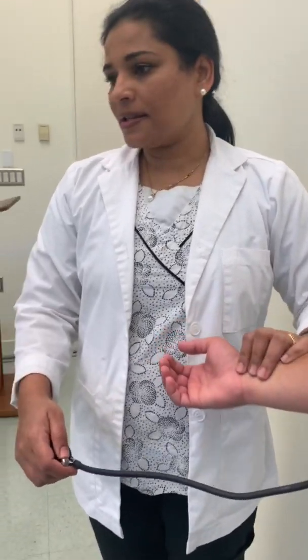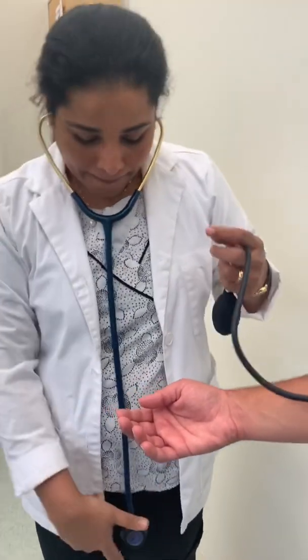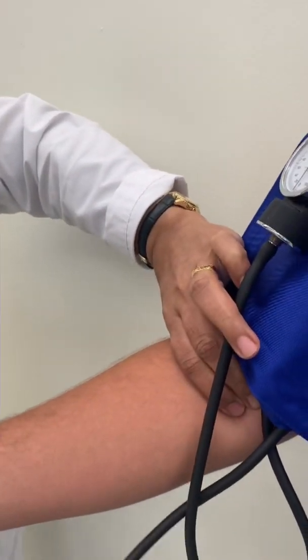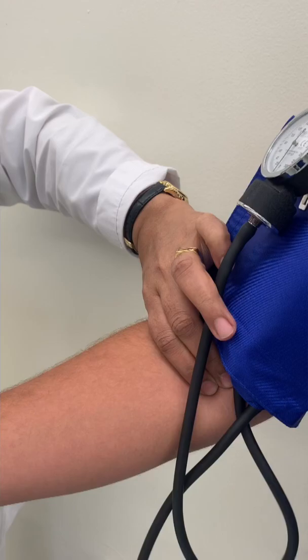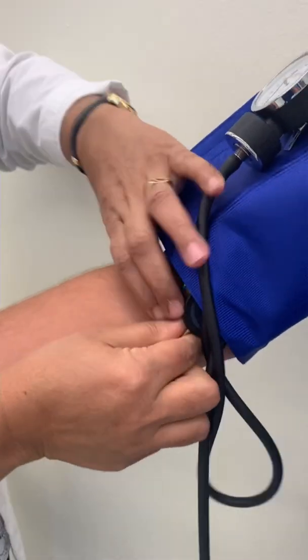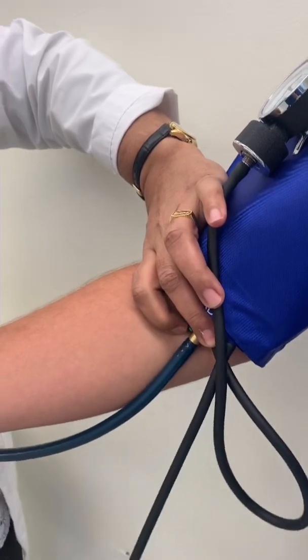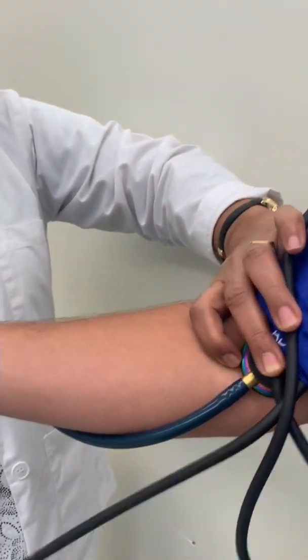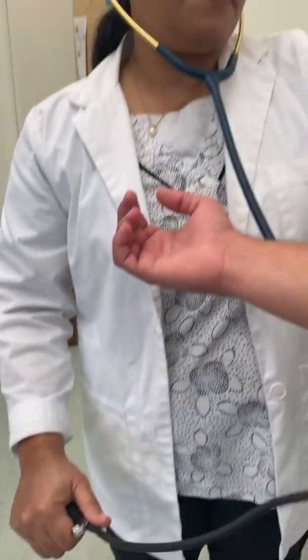In the second step, I'm going to use my stethoscope. I'll feel the brachial pulse, place the diaphragm of the stethoscope there, and inflate again up to 150.